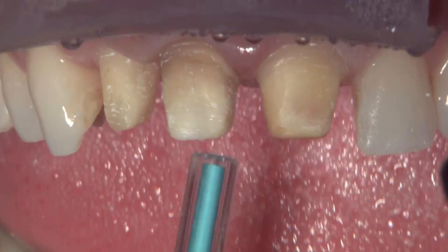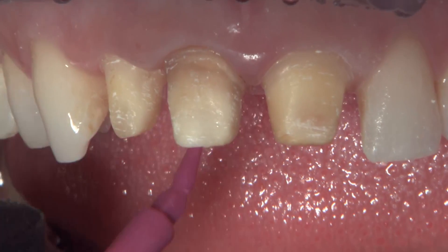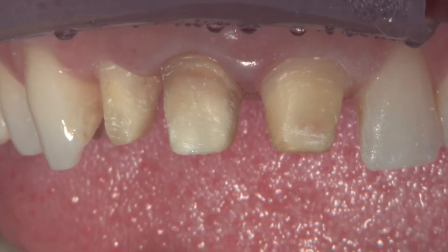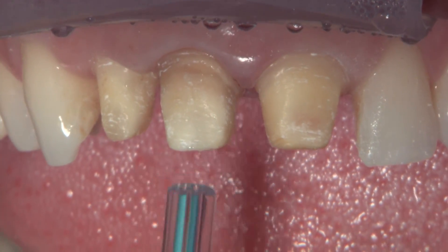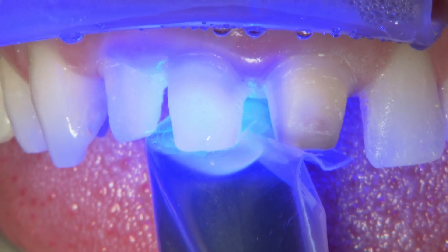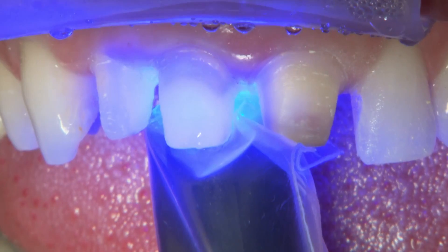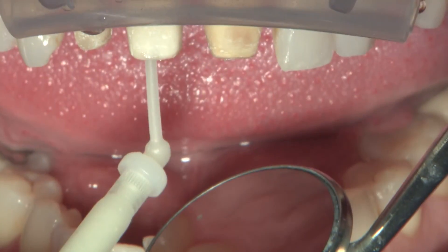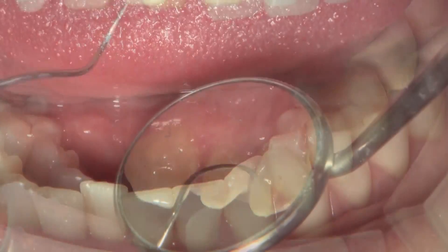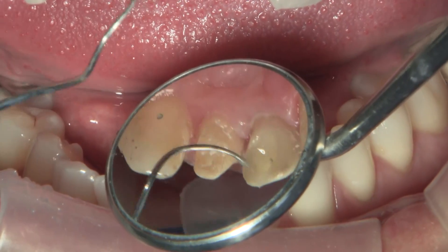There have been times where a doctor prescribed Bruxer anterior for anterior crowns where the teeth were endodontically treated and the preparation was actually showing through. You could call it the downside of having a high translucency material. Unless the doctor can go in and somehow change the shade of the prep, sometimes we'll have to change them over to regular Bruxer material. It's not as aesthetic as Bruxer anterior or Emax, but it will block out more discoloration.